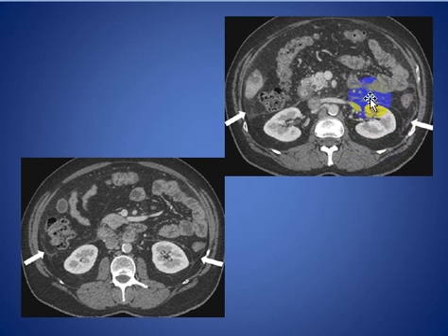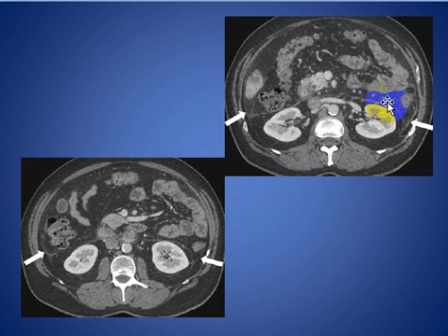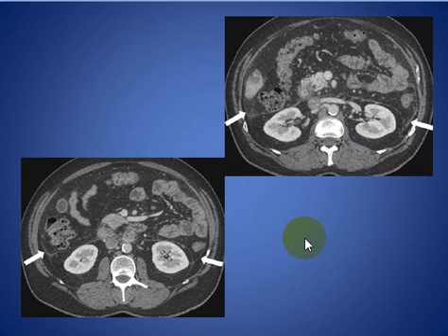As you see here, this is a CT scan at the level of the kidneys, with visualization of the anterior pararenal fascia, the lateral cone fascia, and part of the posterior pararenal fascia. The normal renal fascia thickness is one to two millimeters; if it is more than this, it is considered pathological.